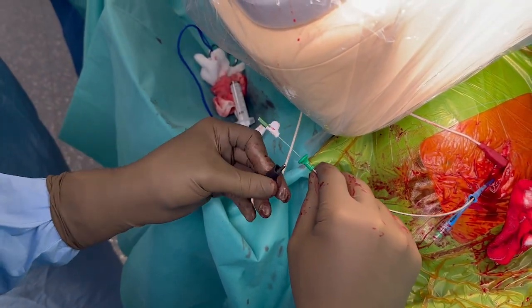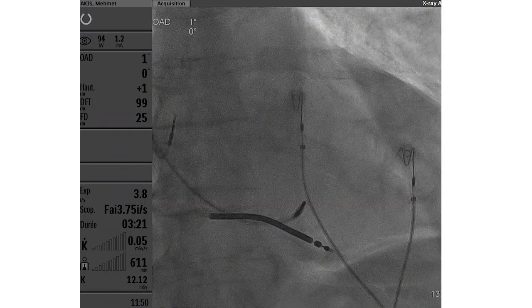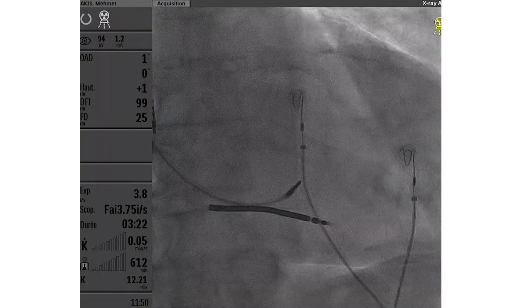One of the major advantages of using a stylet driven lead is that ECG and impedance measurements may be performed continuously throughout the septal perforation process.